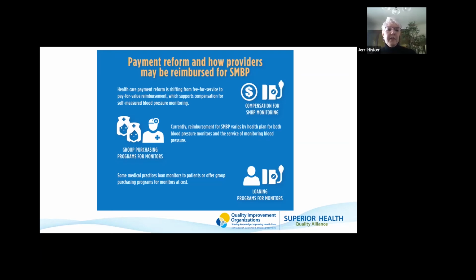As it says here, currently reimbursement for SMBP varies by health plan, for both blood pressure monitors and the service of monitoring blood pressure. So again, you want to look at what your state guidelines are and how some of that is reimbursed by your state healthcare plans. But there are also some group purchasing options you could look into. And then also some medical practices, as we've talked about, if you want to do the loaner programs, that's something you can offer.